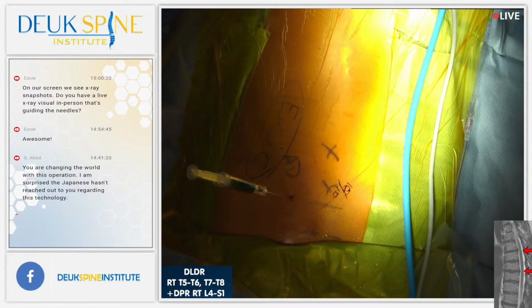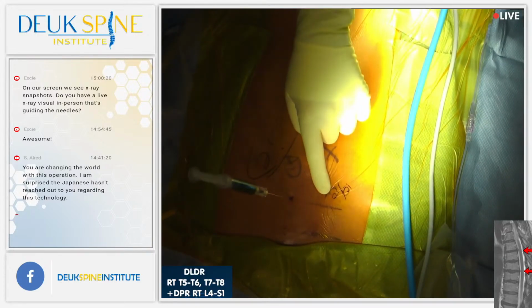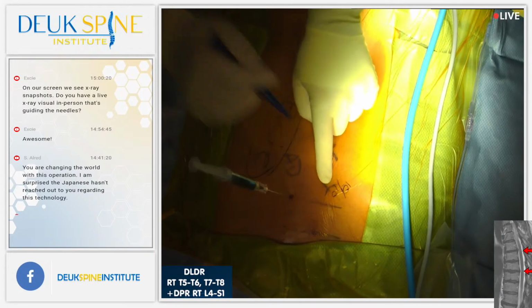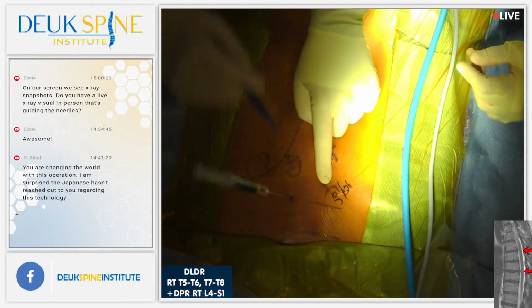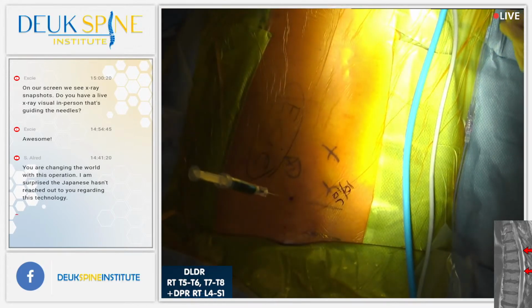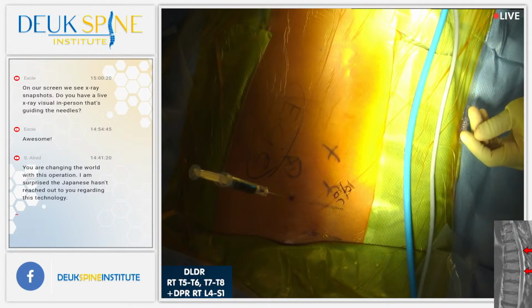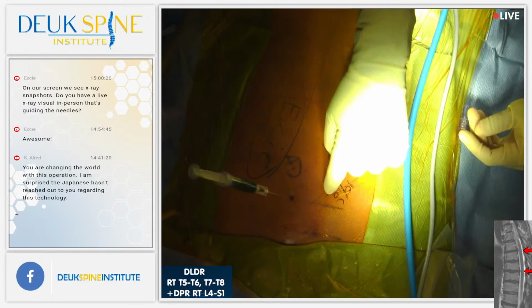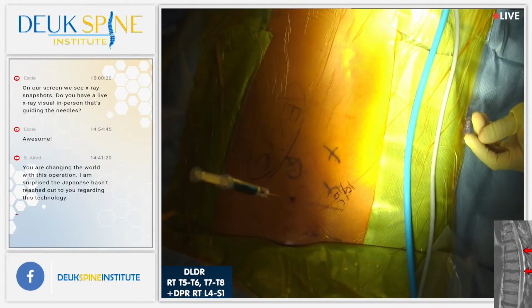based on her MRI, she's got a herniation here and here, which the bottom herniation at 7-8 lines up. You can put her to sleep. Lines up with her herniation at 7-8. She's got 10 out of 10 pain there. Now, when we were trying to get into the higher disc at 5-6, I hit this weird bone growth off to the right side, and she's saying she doesn't have a lot of pain up here. Her pain is here and even here, but this is not a disc that we're treating.